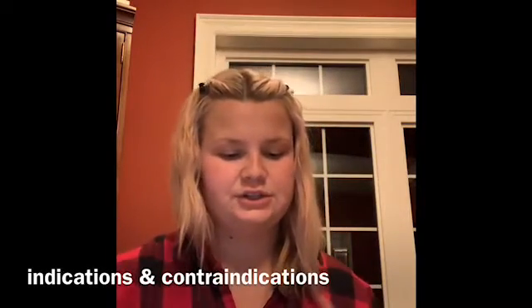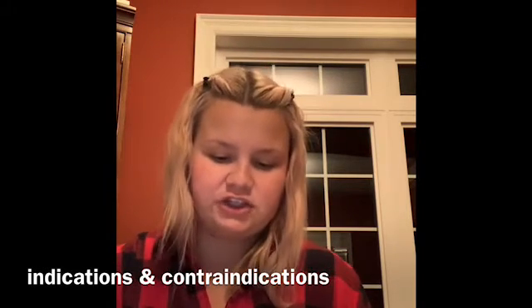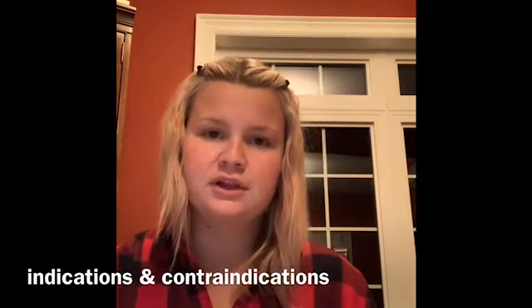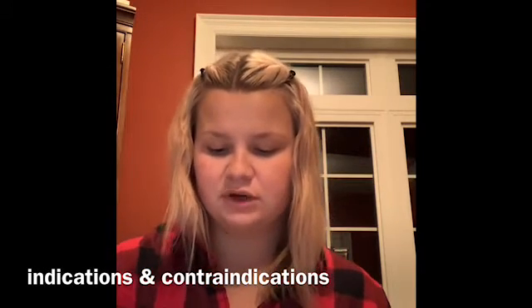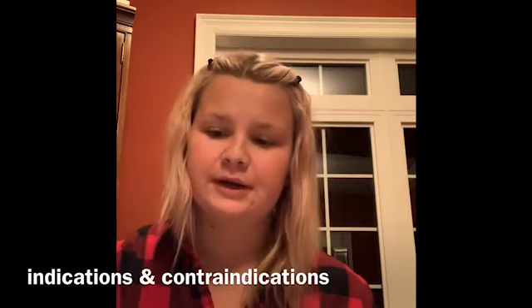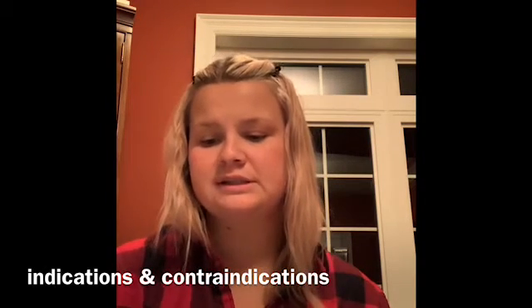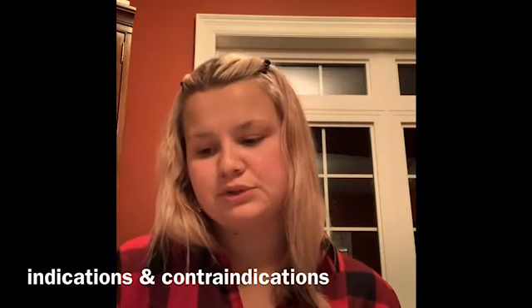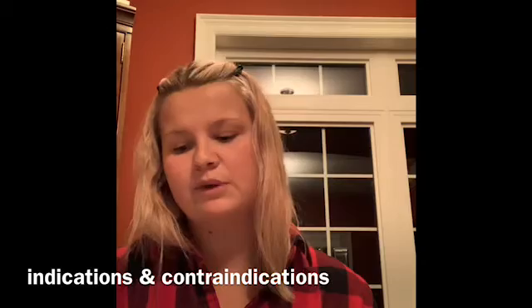Some indications would be removal of the supragingival calculus and difficult stains, cleaning of furcation areas, removal of deposits before periodontal surgery, removal of orthodontic cements, or debonding. Some contraindications would be communicable diseases, patients susceptible to infection, respiratory problems, swallowing difficulty, and cardiac pacemaker.